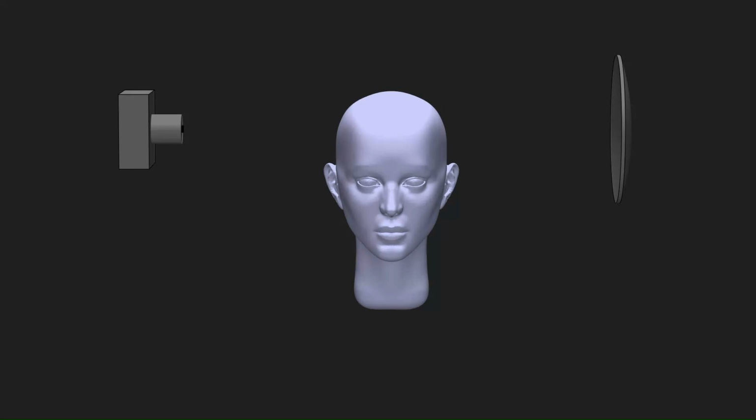Only a pCT scan can tell us how to treat the tumor while sparing as much of the surrounding brain cells as possible. This is due to the range uncertainty issue discussed on our website. Using a low-intensity proton beam available at proton treatment centers, we can obtain a pCT scan of the area around the tumor.